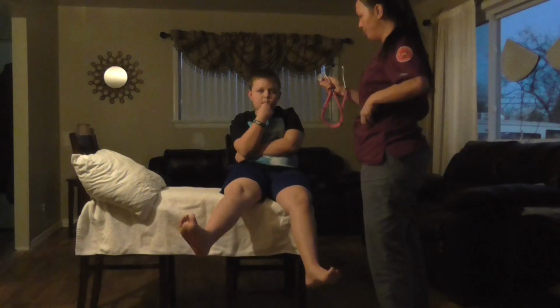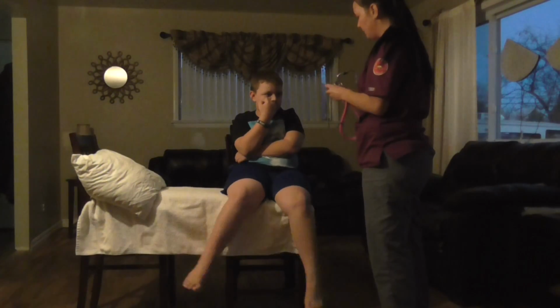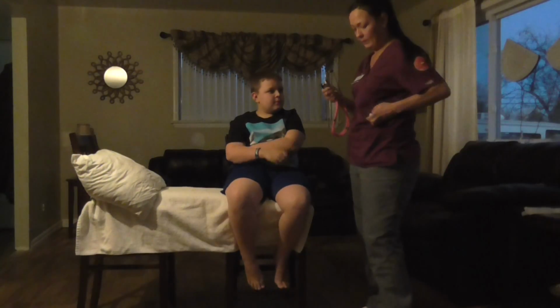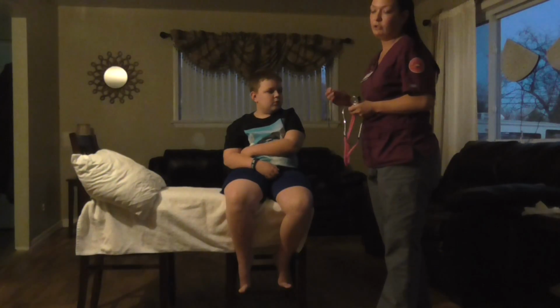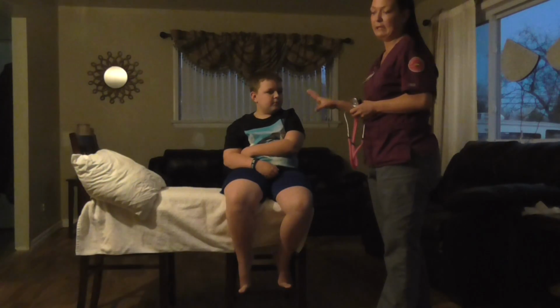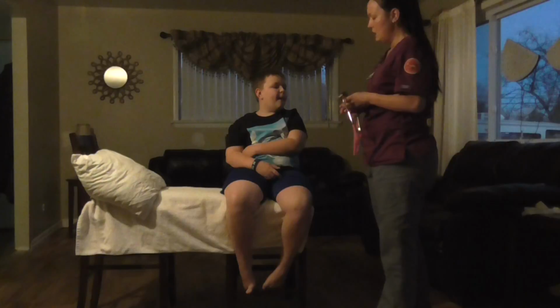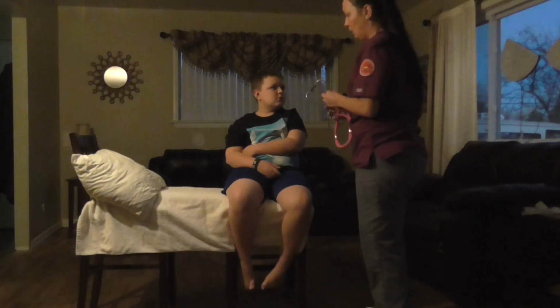During this assessment, I'm going to be using this. This is a stethoscope. And I'm going to be assessing different parts of your heart. Clean it with some alcohol. And like I said, I would put gloves on if needed. Also, another thing I would check for my patient, but not for a child, would be if they use any drugs, if they drink any alcohol, or if they smoke. So, okay, let's move right on in.